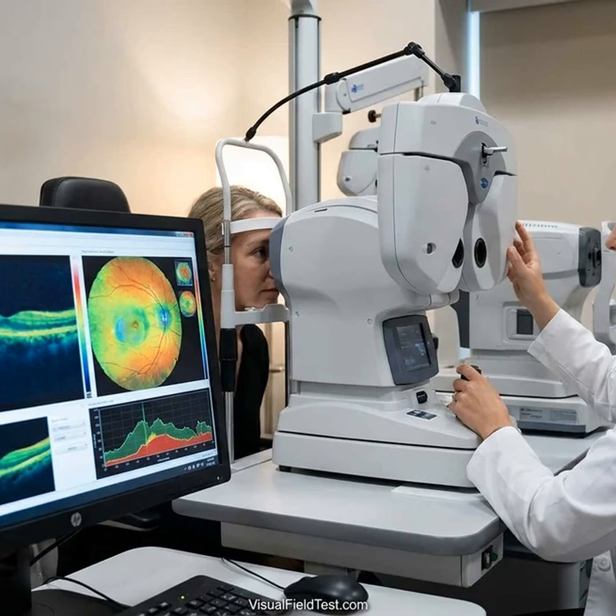Before concluding glaucoma change, how often to repeat OCT in glaucoma? The ideal interval for OCT scans depends on how advanced the glaucoma is and how fast it seems to change. In general, for suspects or very mild glaucoma, if there's only a suspicion and no progression, scans might be done every 12 to 24 months. For example, the European Glaucoma Society recommends initial follow-ups at 6 to 12-month intervals for new cases that are stable. If nothing changes, you might even be sent home longer term. If there are early changes, the doctor will come back more often.